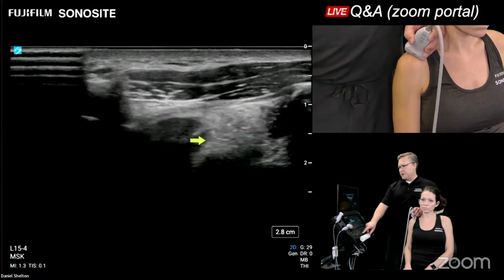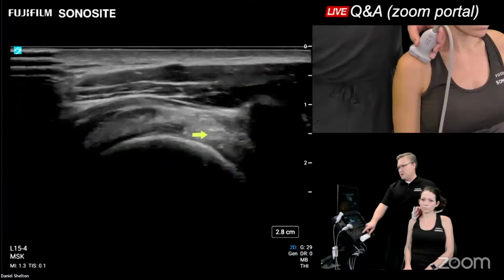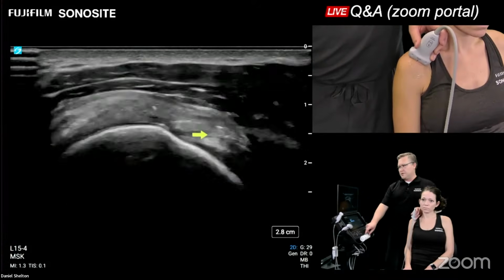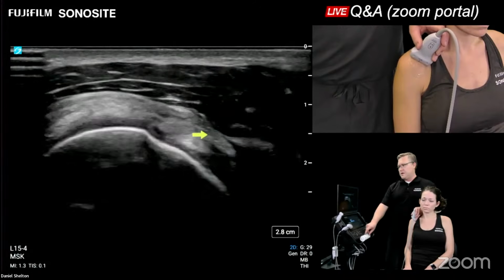We're going to drop down into the rotator cuff. At this point right here, we see the humeral head. And as we sit anteriorly, and this is really without stressing the shoulder, I don't see any point in putting our patient into a lot of positions they don't need to be in until we see that the obvious stuff is okay.